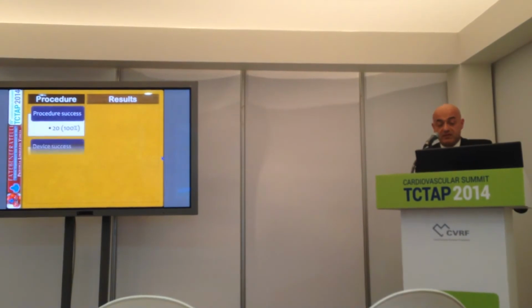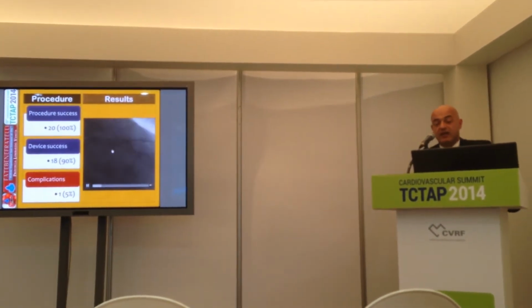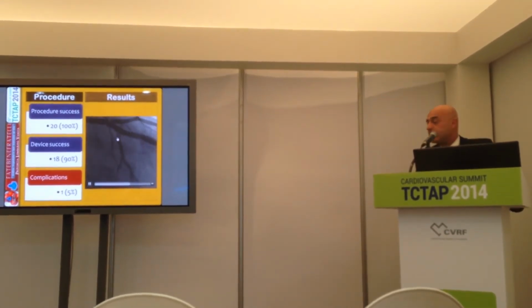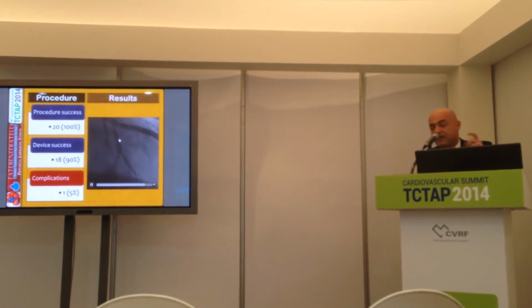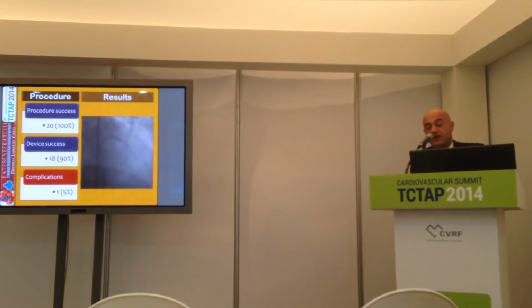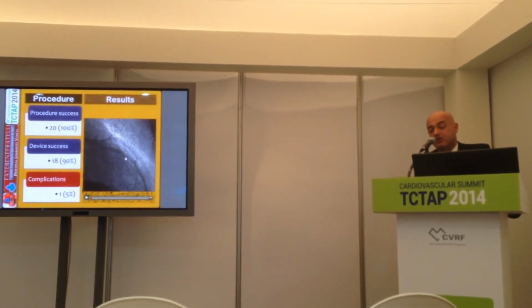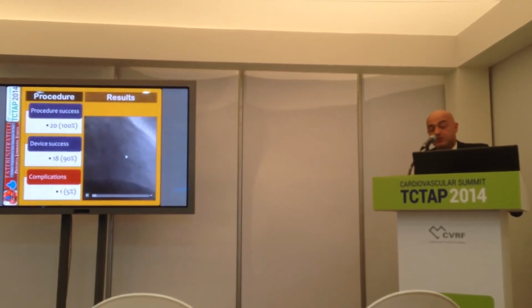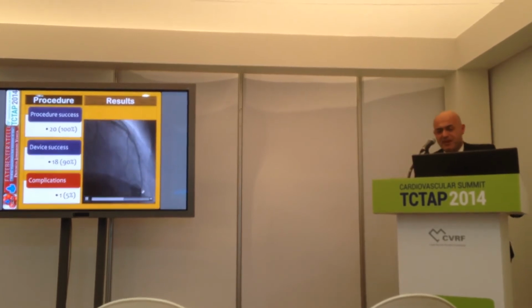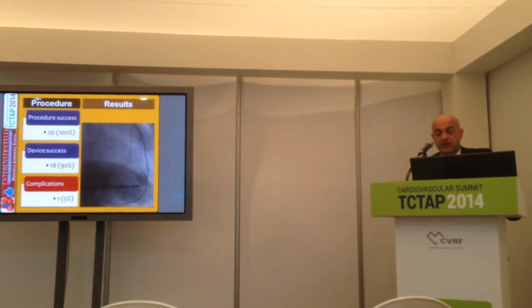About the complications, 1 patient, this is the access stent in his LAD, and you can see here inside the stent there is a haziness, which is acute thrombosis inside the stent. So obviously Reopro and balloon, and here after the dilatation you can see some migration of the thrombus. Well, treated with several balloons, at the end the result was good. Maybe here distally there is some distal embolization of the vessel.